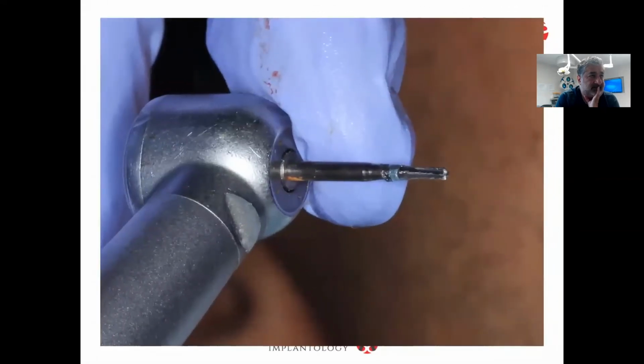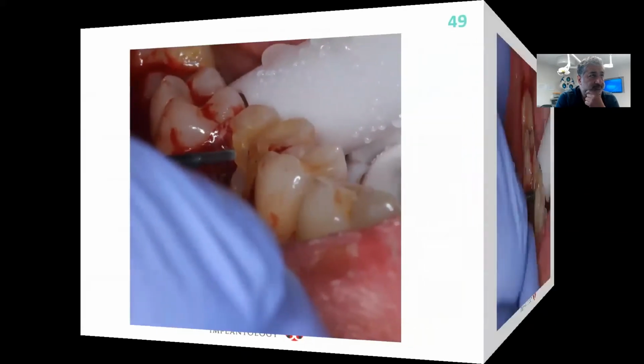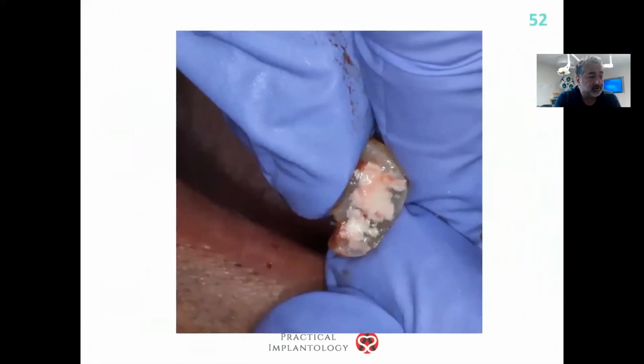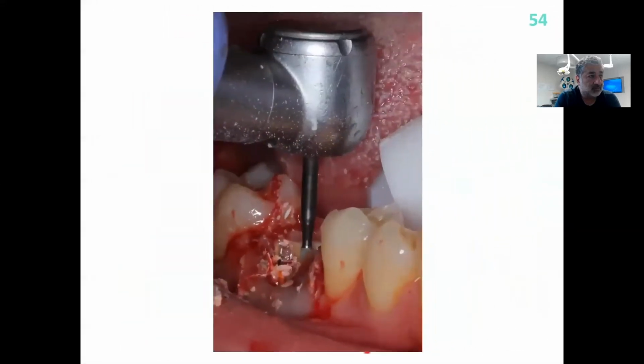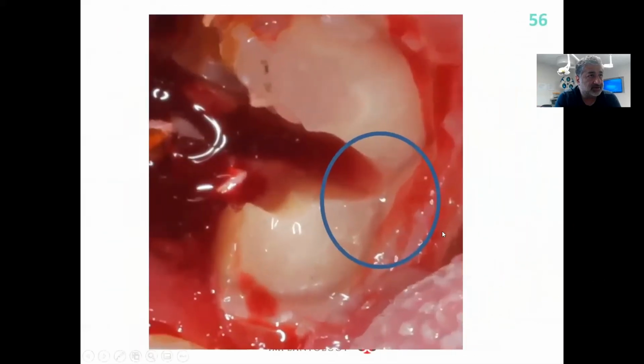I then take this fantastic tri-hole burr, and I decoronate the rest of the root. Once it is decoronated, I take that off, have a good look again, and then I will bisect this two-rooted lower molar right through to the furcation. It is important to understand, especially when you go into the lingual, try to leave this little sliver in place, because you'll go through the lingual plate, which could be very thin.